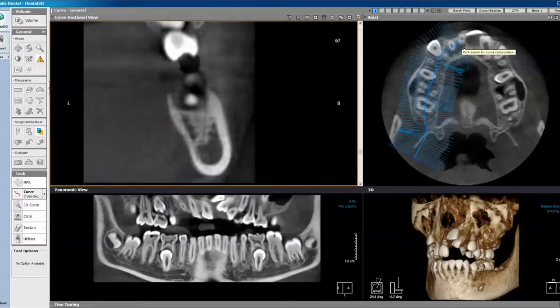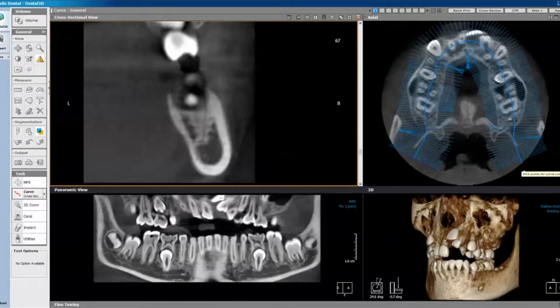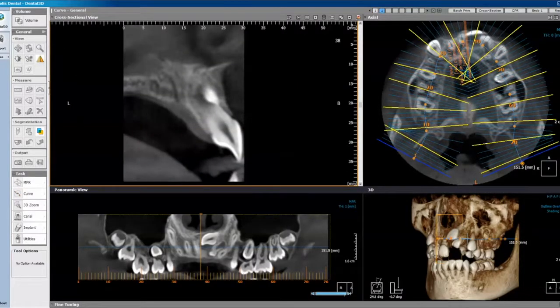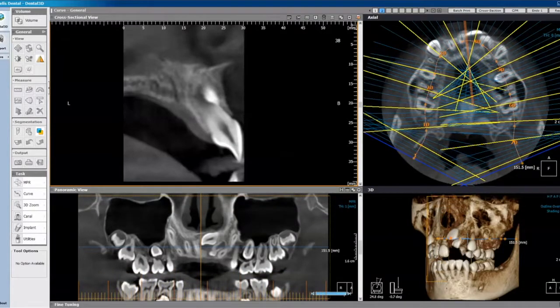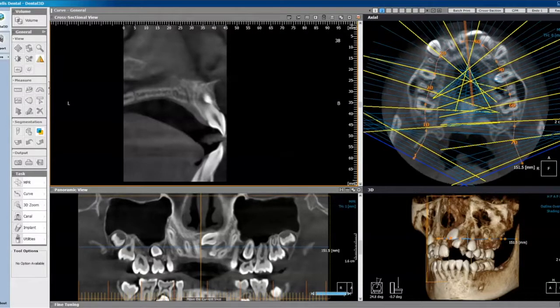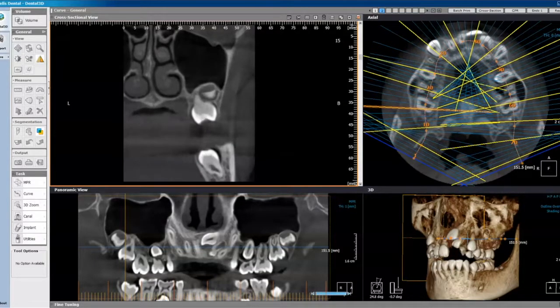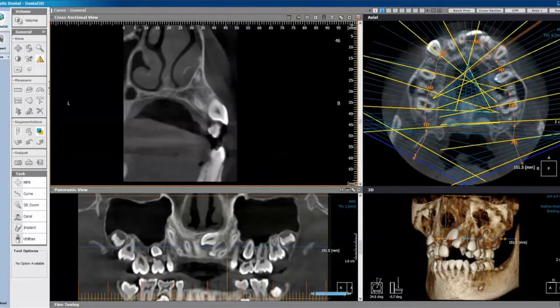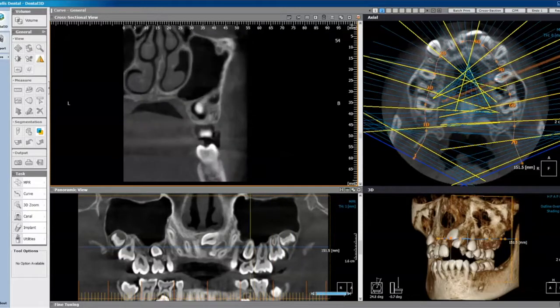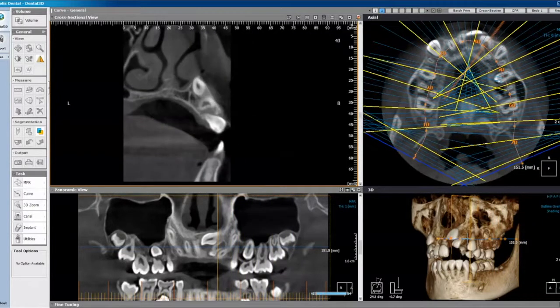Any time I need to make a directional change I'll click the left mouse button and go along the path of the maxillary anatomy, and double click at the end when I'm ready to complete that line. These cross hatches are developed at millimeter increments along this line. I can travel along it by going to the lower left pane and sliding the transaxial reslice line, going back to the posterior maxilla on the right near the pterygoid plates, and continue to travel along that line to the posterior left to see the anatomy of the maxilla.